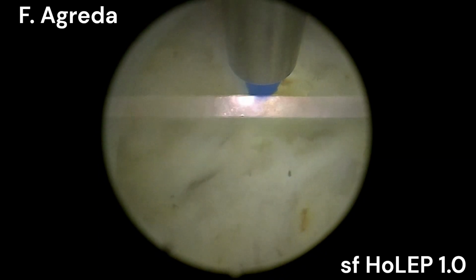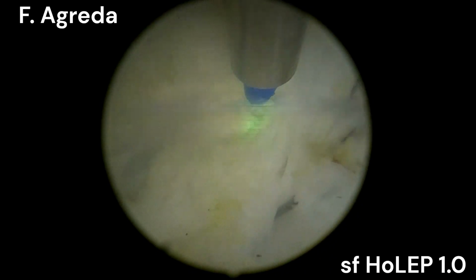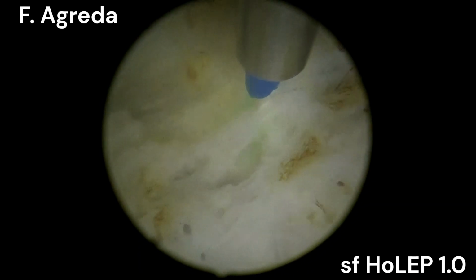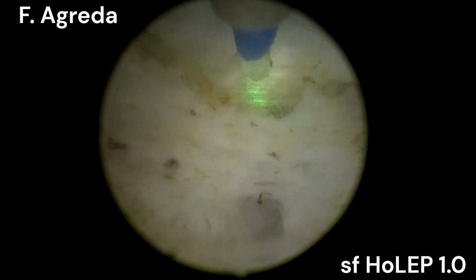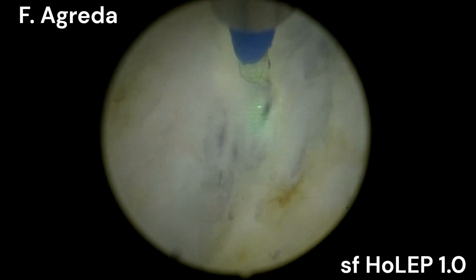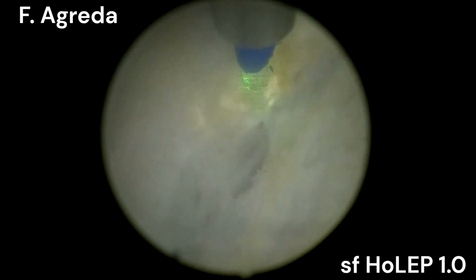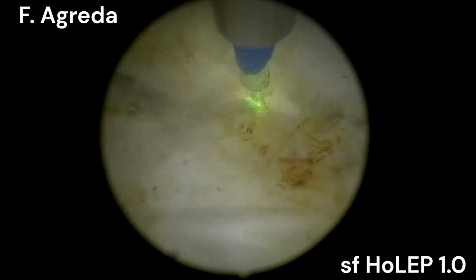laser enucleation of the prostate, and in this case, if I'm performing the surgery, I will go with my own sphincter first HoLEP. So as you can see here, we complete the plane of the section. We have a complete semicircular plane starting from around 7 hours to the 5 hours and the distal aspect of the adenoma. So now we only have to continue this plane till we get to the bladder.